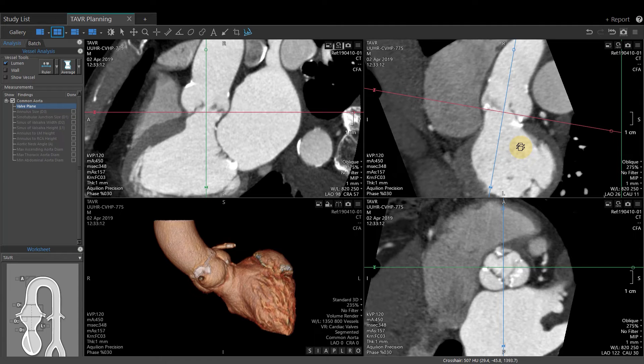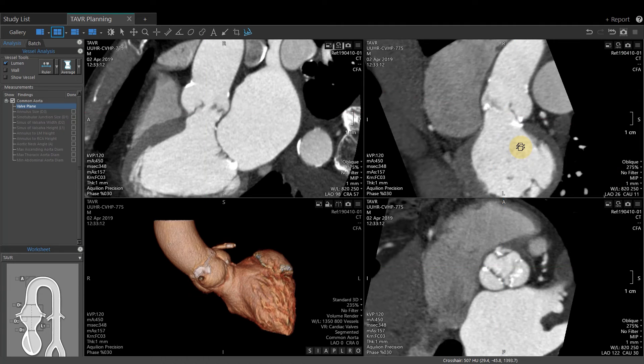Once you let go of the left ALT key, the crosshair has disappeared and the tool that was previously activated is now back.